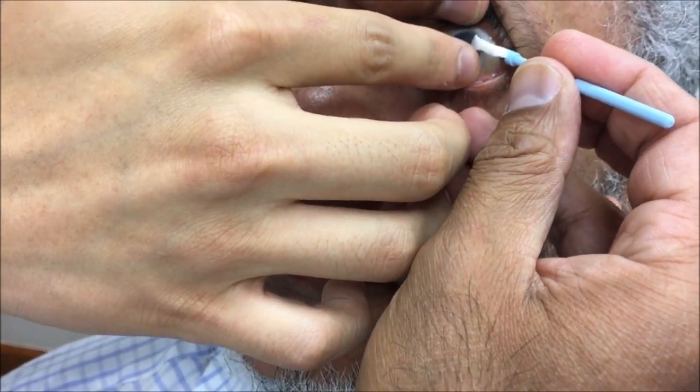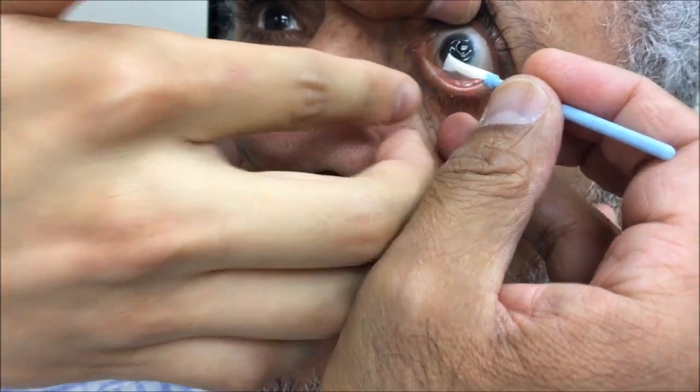Look up a little sir — look up. Very good.